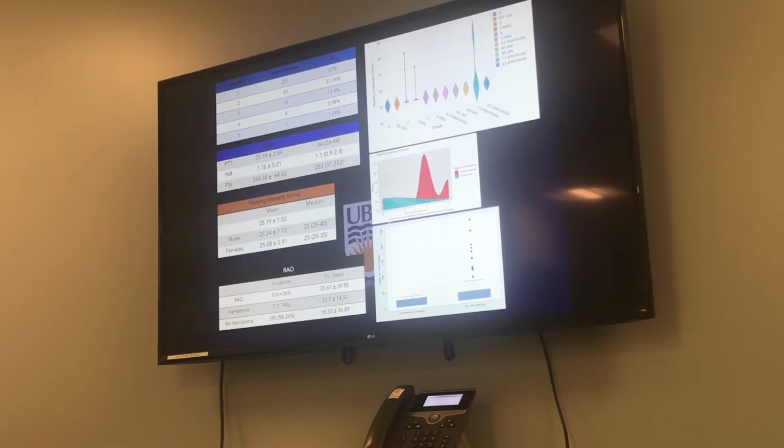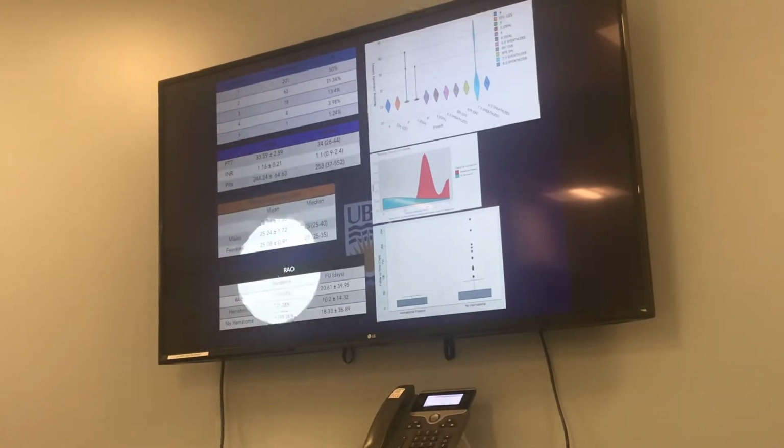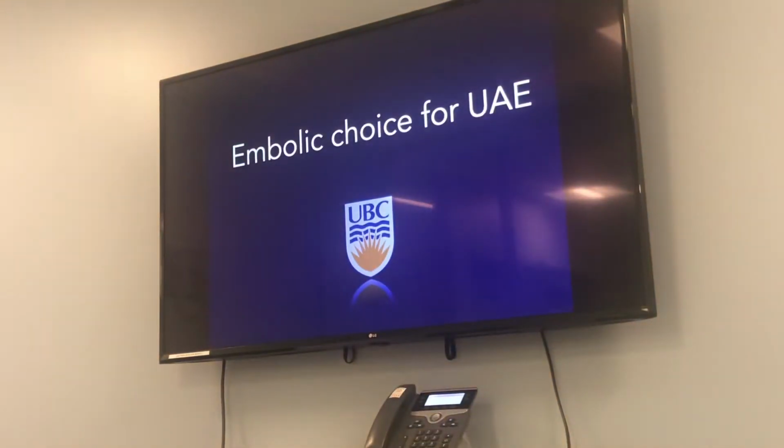So the big things that came out of this paper, number one, the nursing intensity was extremely low, because you only really have to worry about that wrist for 25 minutes after the procedure. Radial artery occlusion rates were 0. Small number of hematomas that happened very early on in our experience. So that's really been the biggest advancement, I think, in terms of what we do for these patients. And then these are just the cluster of cases. You can see we didn't include any fibroid patients in this study, but we used big sheaths, lots of heparin in it. It doesn't seem to be a problem.